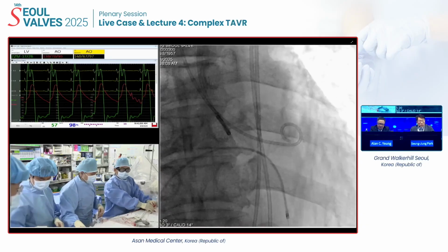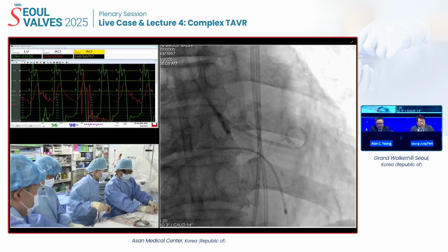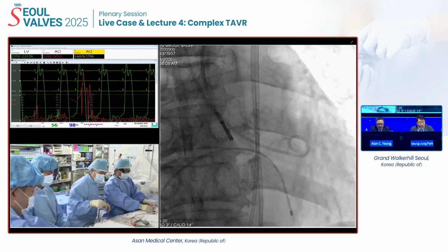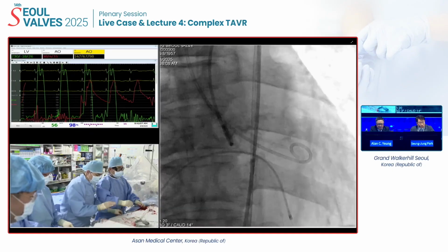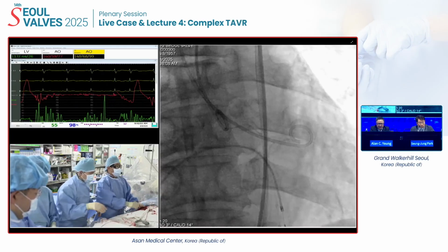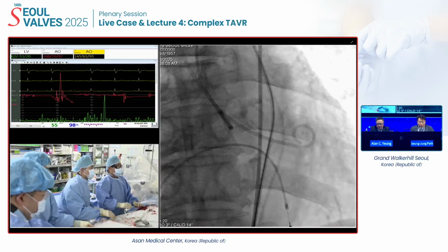But sometimes the jet could be very eccentric and push you somewhere else. The light wire, meaning the glide wire, could be very difficult because it tends to flop around in the jet. It's like trying to push a spaghetti through a strong wind, and you will never get through it. So I think the Emerald wire is what we use in those situations.